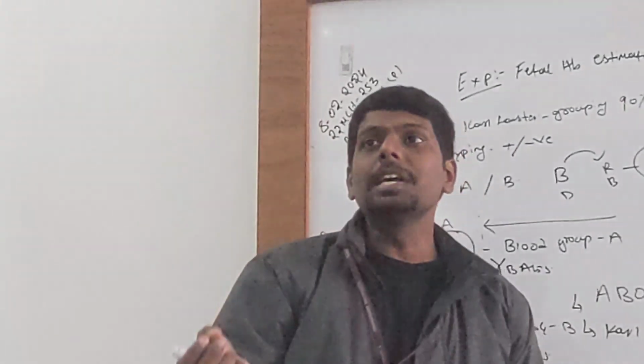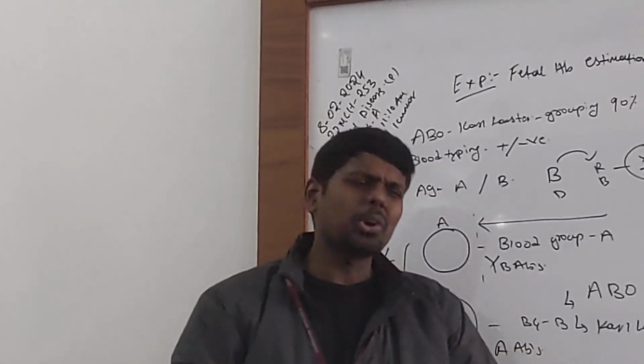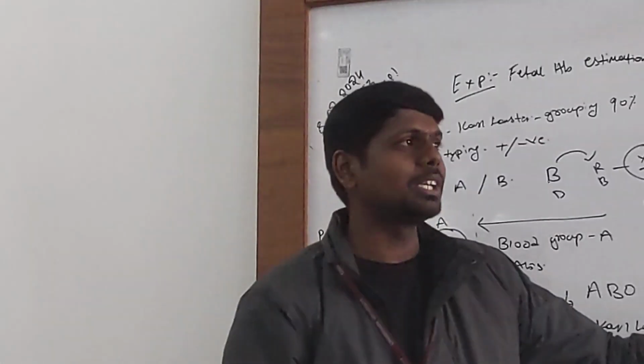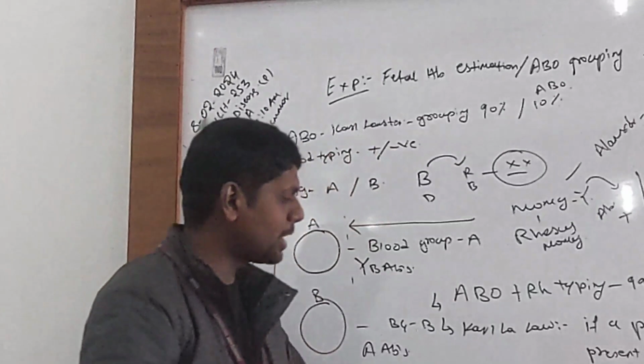For example, now listen, sometimes there won't be a clinical history. Better do cross matching every time. This is called cross matching. Better, before transfusions, do cross matching. Okay, then only you proceed for the next steps.